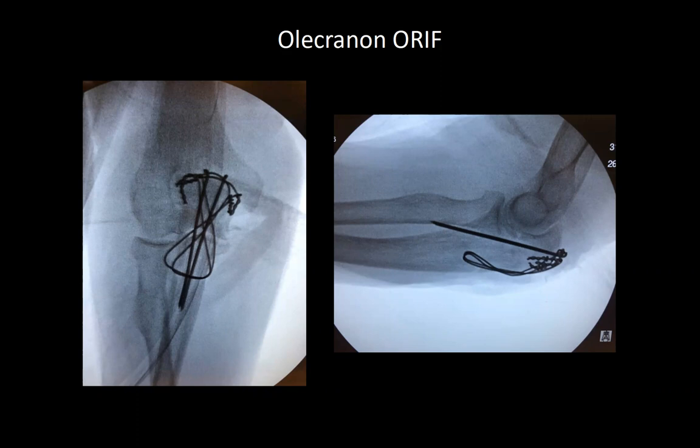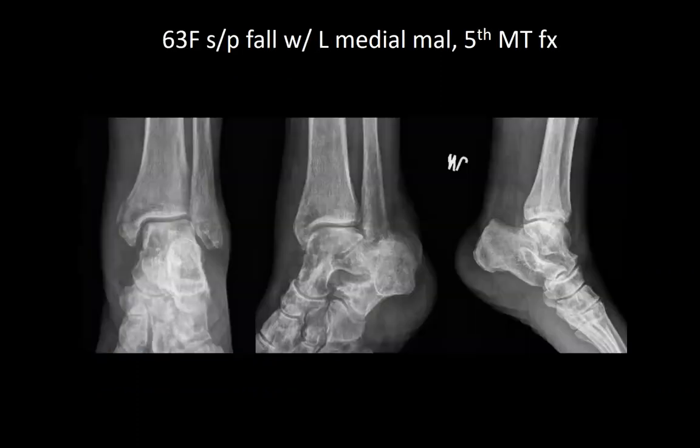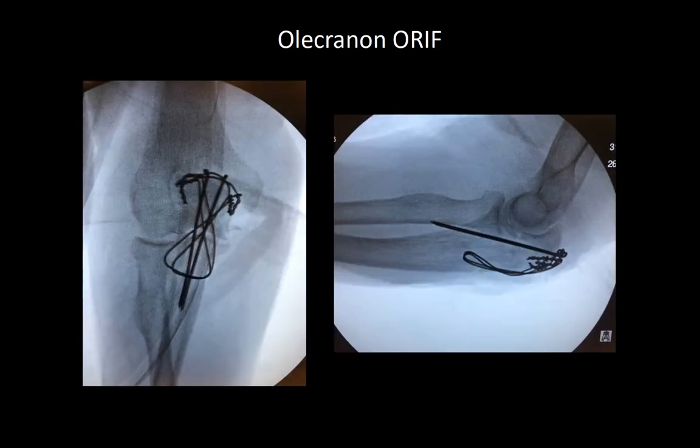I don't want to. This is actually not worth arguing about. Let's move on. Hey, Jeremy, I just have a quick question for you on that one. What nerve are you worried about there and why? Yeah, so you're worried about the AIN, which comes out like a centimeter and a half distal to the coronoid there. So you worry a little bit about the K-wires penetrating the anterior cortex there. I think they're a little past that, so we should be okay.